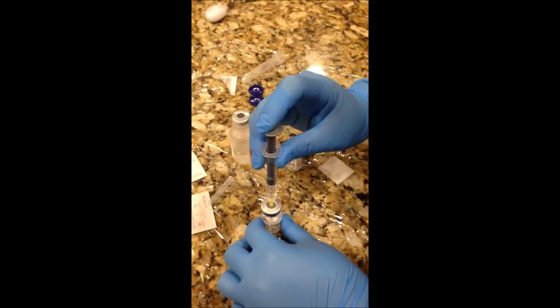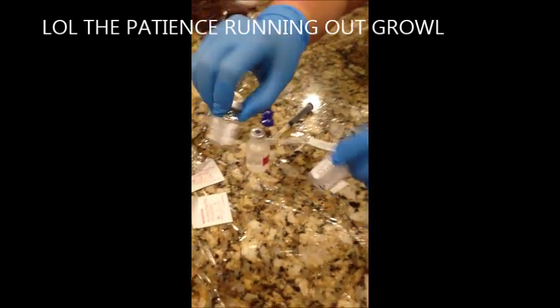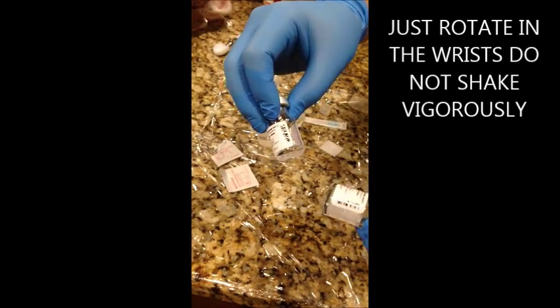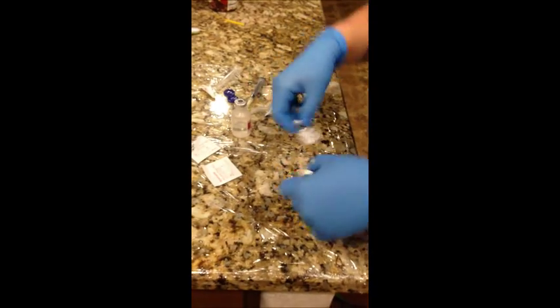One ml into each, and then you're going to cover the needle. In order to mix it, you don't do a vigorous shake — just until the liquid dissolves. You'll see that it starts to dissolve, and when there's a little bit left, you just keep going gently.